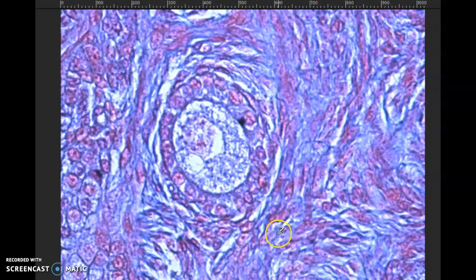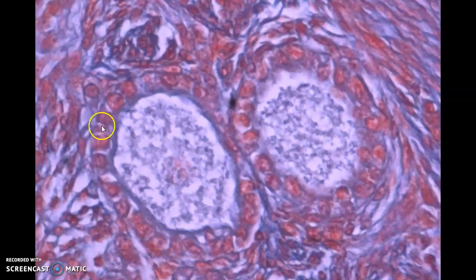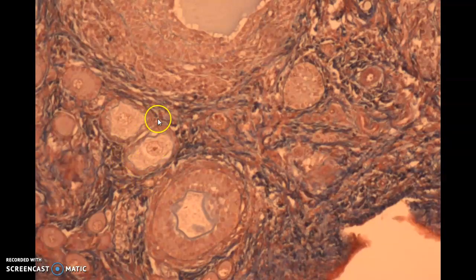This slide actually sort of looks like Starry Night, but we can see our oocyte here. And in this one, I can see, yes, I have cuboidal epithelial. And this is an early one right here because it's simple cuboidal. It's eventually going to become stratified cuboidal. So here's a pair of them right next to each other. Again, simple cuboidal on those. And these would be late, right? This one and this one. And I know they're still primary follicles because there's no antrum.